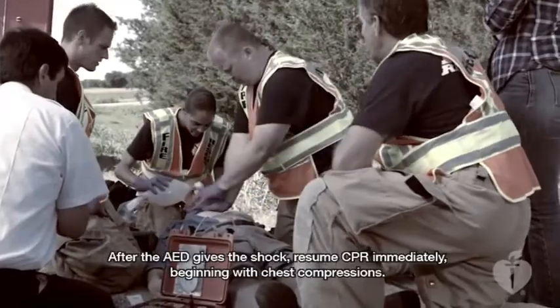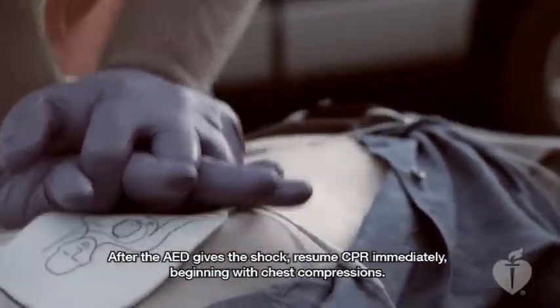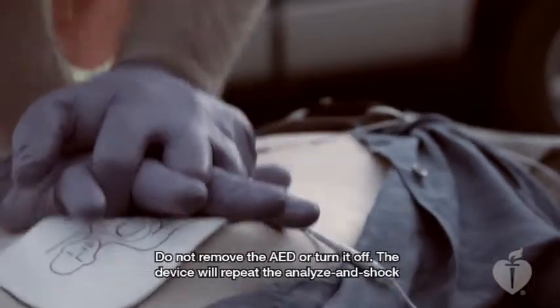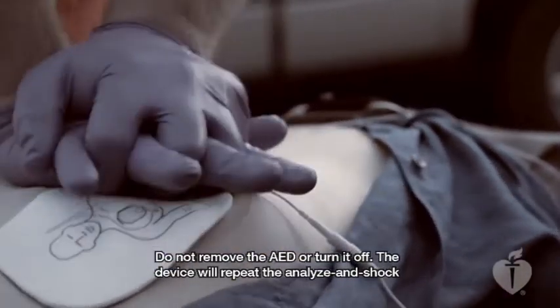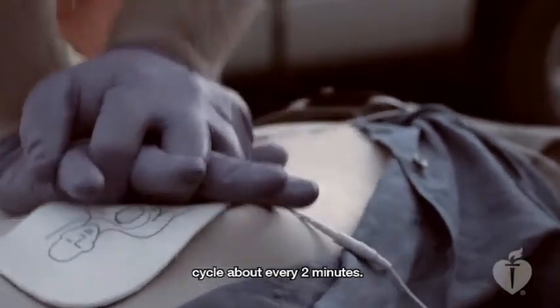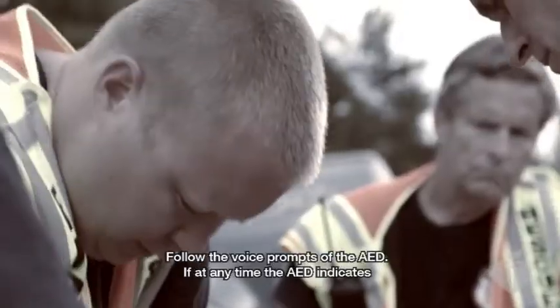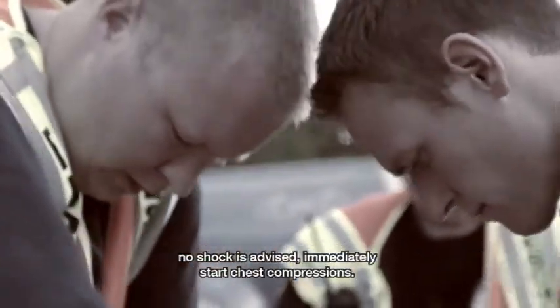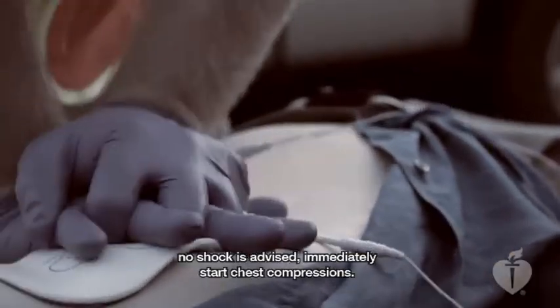After the AED gives the shock, resume CPR immediately, beginning with chest compressions. Do not remove the AED or turn it off. The device will repeat the analyze and shock cycle about every 2 minutes. Follow the voice prompts of the AED. If at any time the AED indicates no shock is advised, immediately start chest compressions.